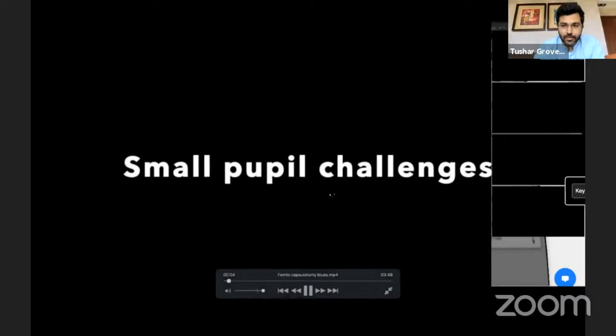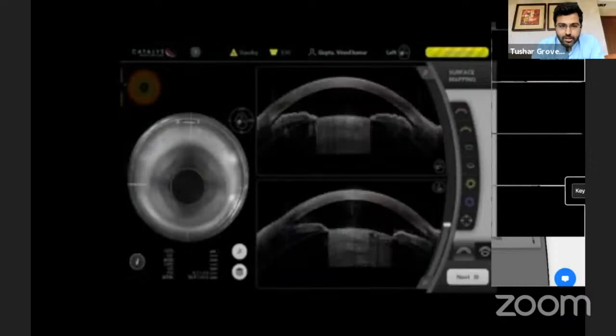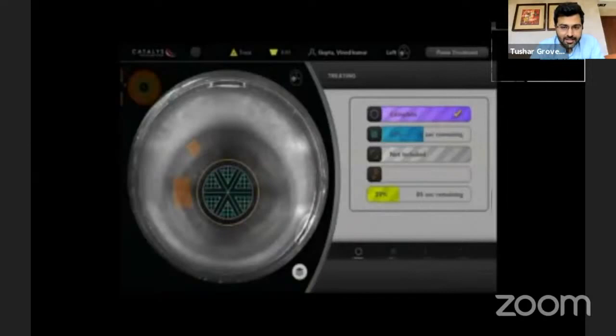I'll be talking about issues that happen with femtosecond capsulotomy, and one of the common situations where this happens is when you have a small pupil. Something that usually works well is by cheating the machine a little bit — we manually adjust the diameter of the pupil that the machine has detected and increase it manually. That usually works well.